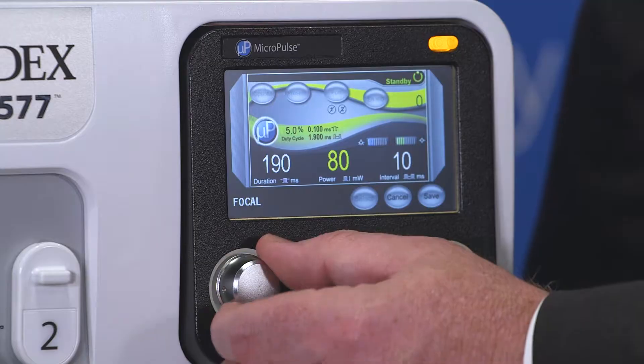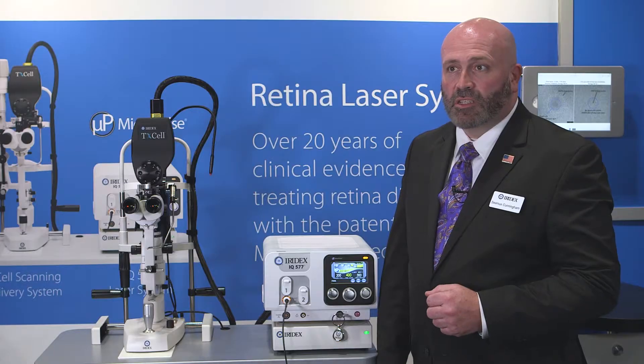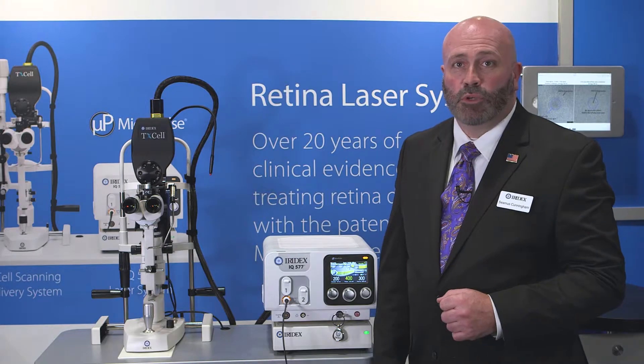The next step is to program your duration, power, and interval. You can do this by rotating the knobs under each setting. Once you have this set, you can press Save. You can now select that setting and it is saved as a preset.